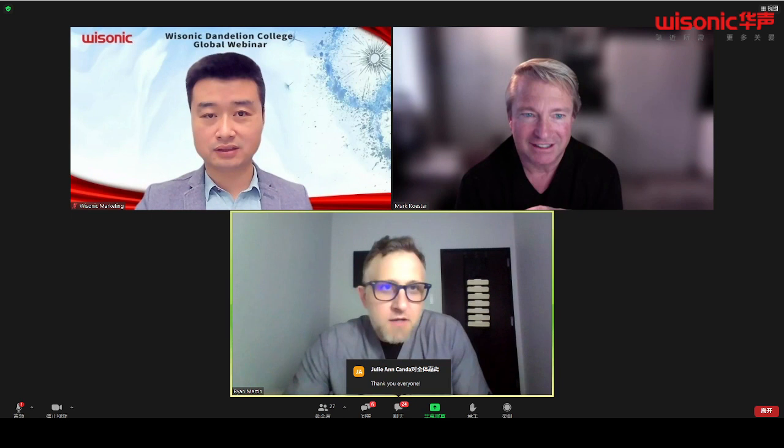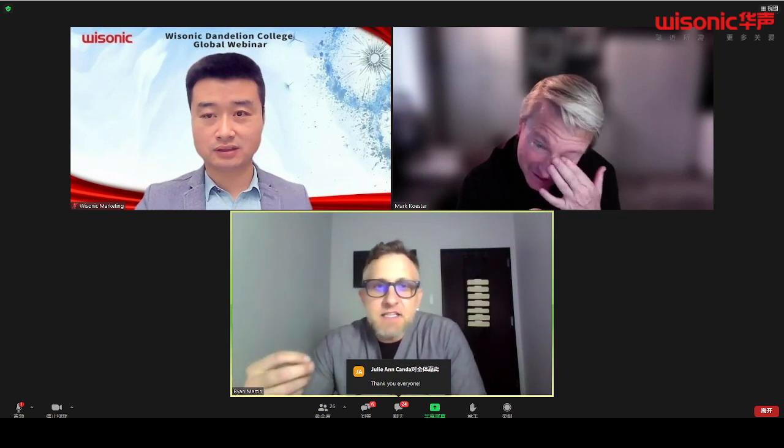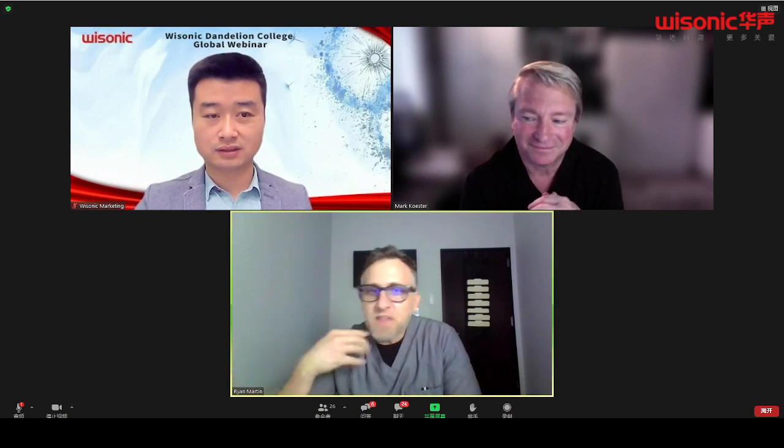Let's see. Hello, Dr. Martin. May I ask what the best frequency of your linear probe you recommend for elbows? Well, elbow is most typically a superficial structure. Now, you're going to get some big elbows, but that doesn't mean you need a big probe. The higher the frequency, obviously, the higher the resolution, but the more superficial the structures.